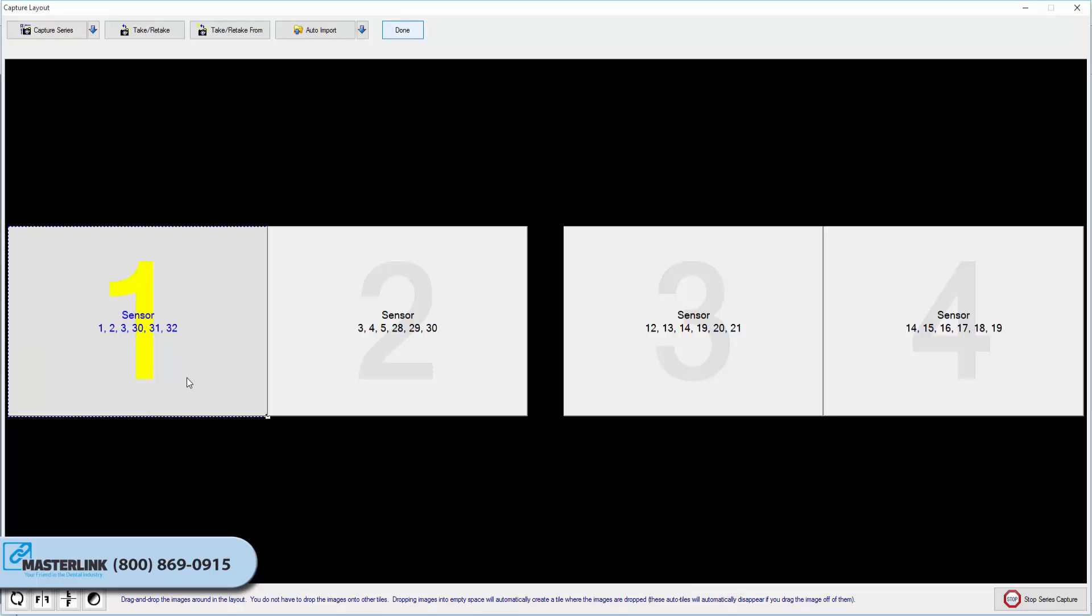The selected layout will open up in Capture Mode. Note that the first tile in the series is selected, awaiting an image capture. Additionally, note that the tile capture order is indicated by a large yellow number, and the related tooth numbers are displayed in each tile.